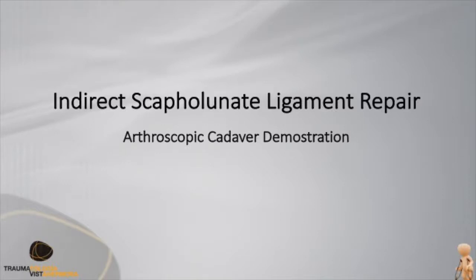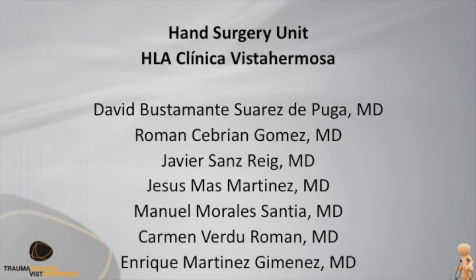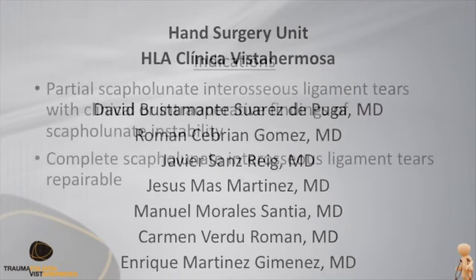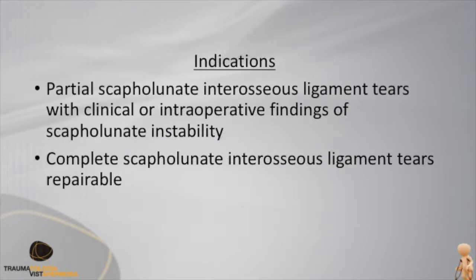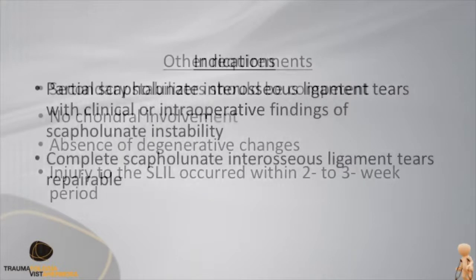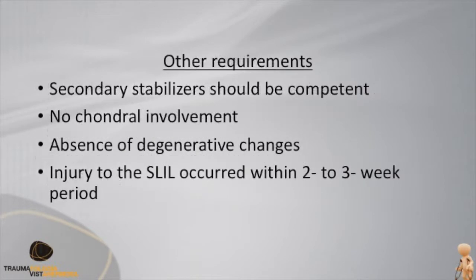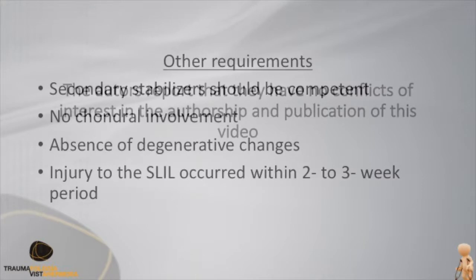We present an arthroscopic technique of an indirect reconstruction of the dorsal scapholunate interosseous ligament for scapholunate instability. This technique is indicated for patients with acute injury in which the scapholunate ligament still maintains some potential for healing.